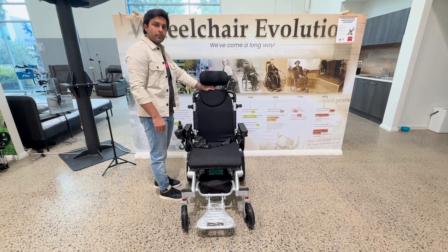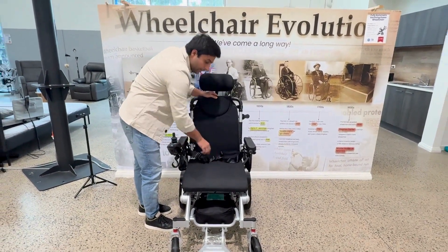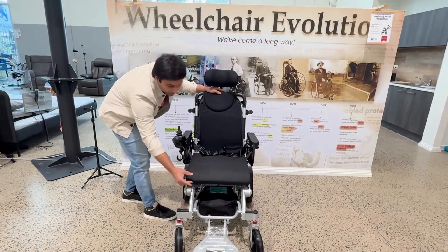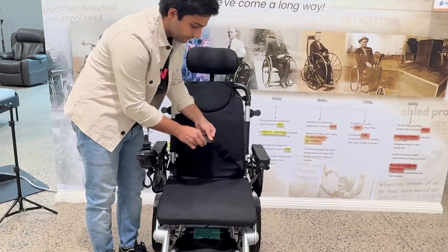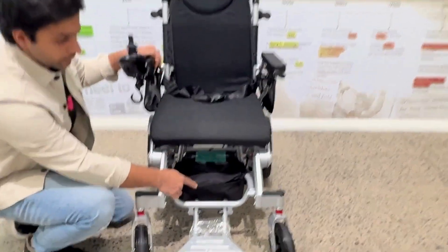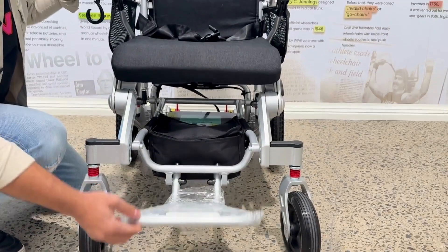Coming to the front profile of this wheelchair, the width of the backrest is 46 cm and the height of the backrest is 56 cm. The width of the seat rest is 46 cm and the length of the seat rest is 46 cm. The height of this cushion is 7 cm. It comes with a safety seat belt, and you can also adjust the mat. It comes with a storage bag where you can store your essentials and 8 shock absorbers. You can also fold the footrest.